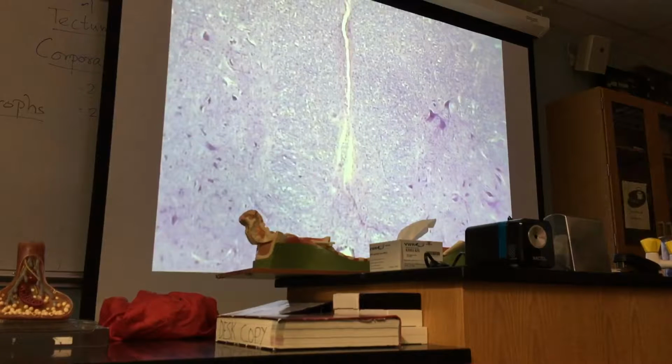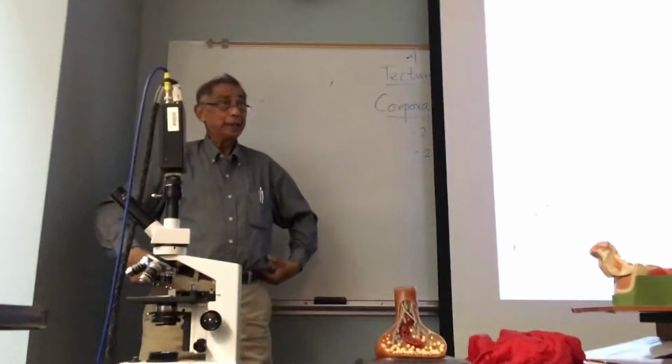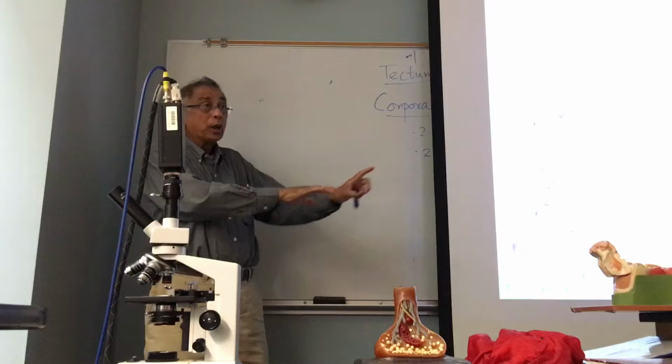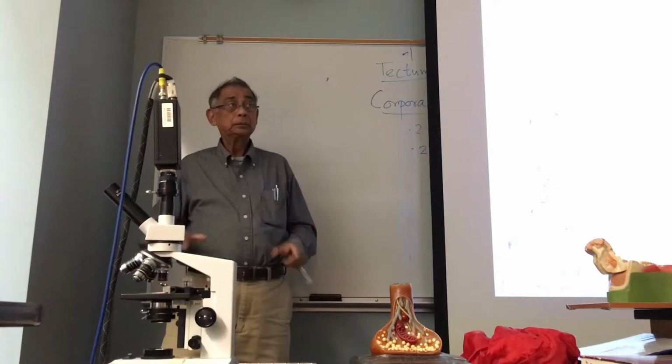So this anterior median fissure will determine the anterior side and posterior side. There are two terms you should know, and this is for human beings, because we have what kind of posture? Erect posture. We are not like the four-legged creatures, like a dog or a cow or a rodent.